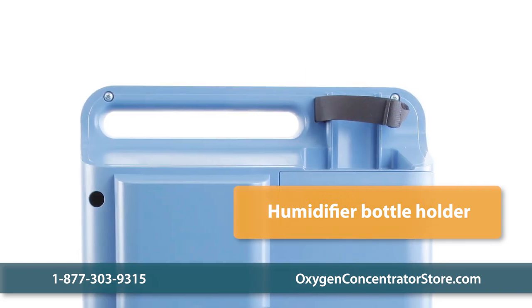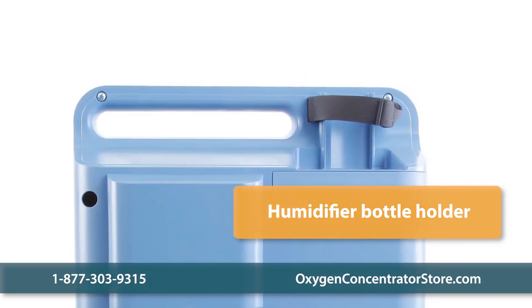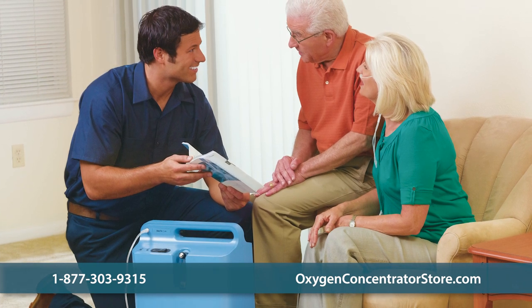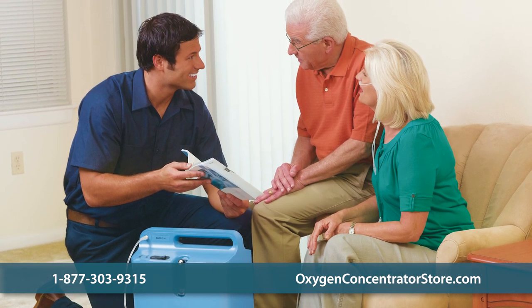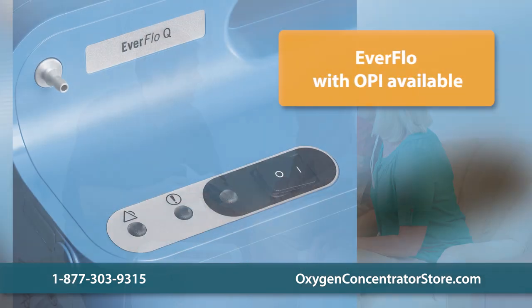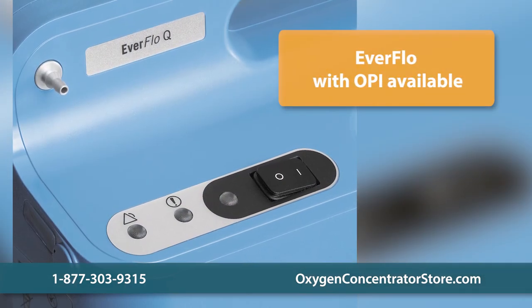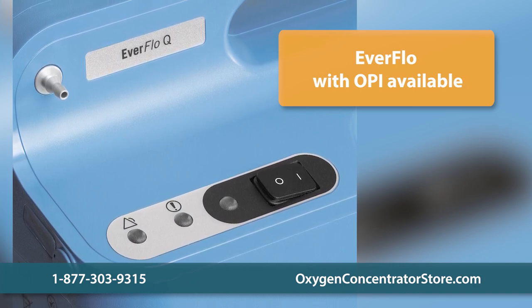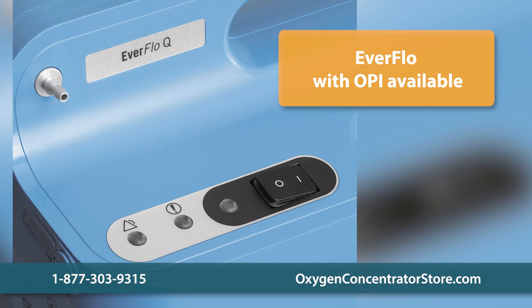It also features a humidifier bottle holder that is compatible with all bottle styles. With only two highly efficient filters and a lower energy cost than other home concentrators, the unit is easy to maintain and cost-effective. We also carry the Respironics Everflow with an oxygen percentage indicator, which ultrasonically measures oxygen purity output and sounds an alarm if oxygen purity falls outside acceptable levels.